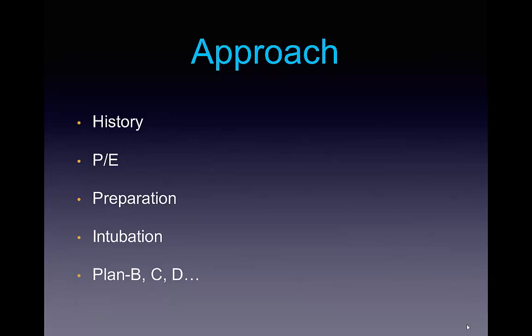And of course, just like any other medical procedure, preparation is important, and we will discuss this in detail with regards to pre-oxygenation, induction, and post-intubation care. In addition, the actual act of intubation needs to be thoughtful and prepared so that you can be ready for any adverse events and if you need to change to a different airway adjunct. Therefore, for intubation, just like other procedures, you need to have a plan B and a backup plan to that plan, a so-called plan C and D. And all of this goes in a way of making this procedure both safe and rewarding.